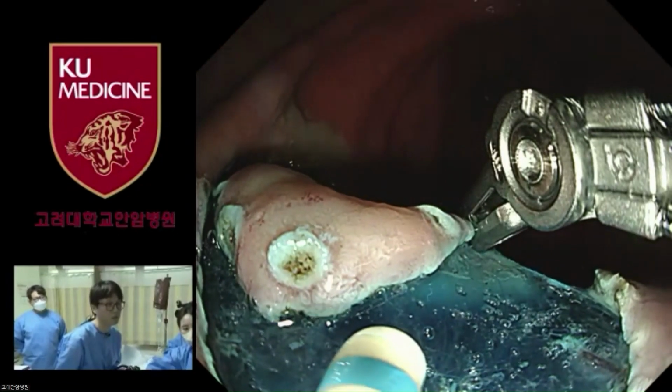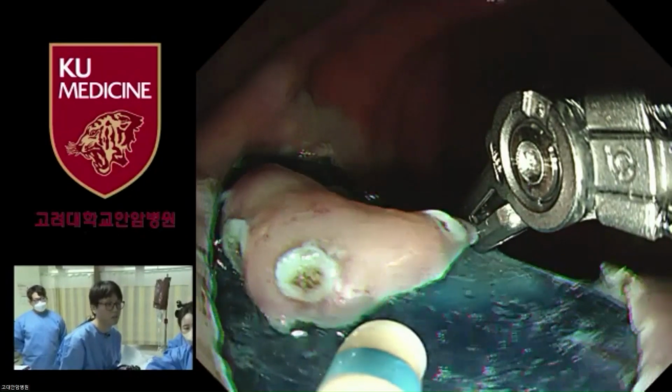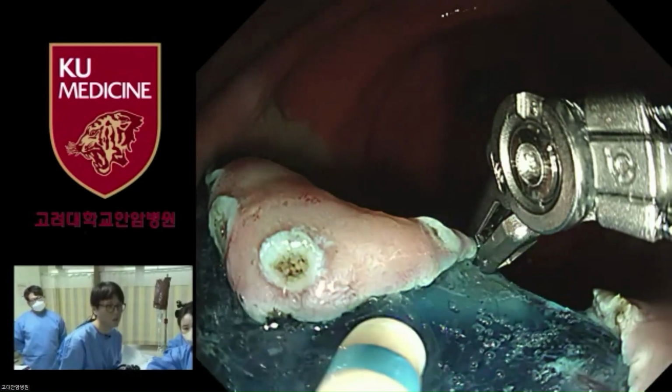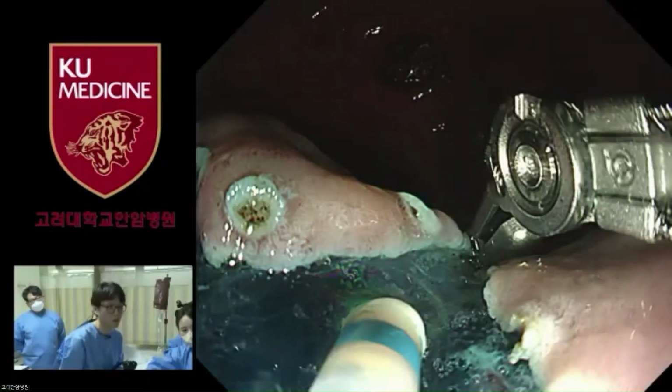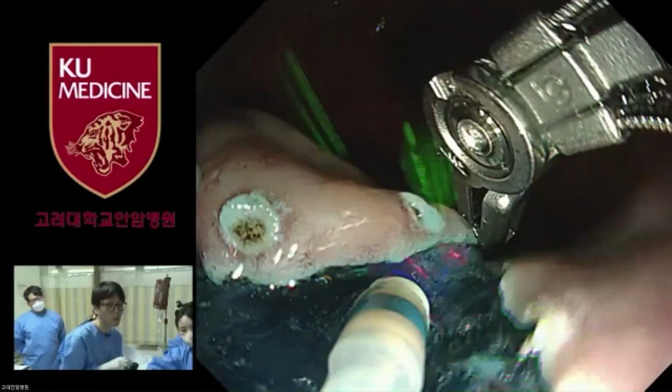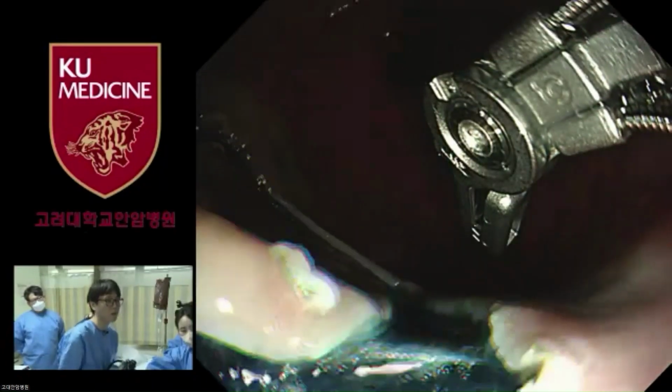So we want to just try first without additional submucosal injection. Okay, he is starting the submucosal dissection.